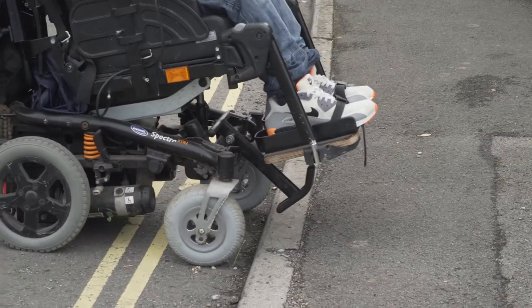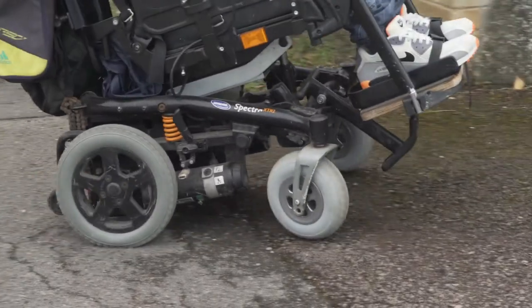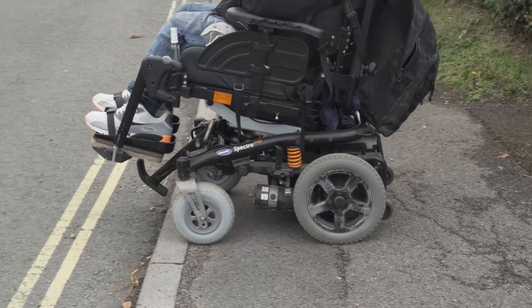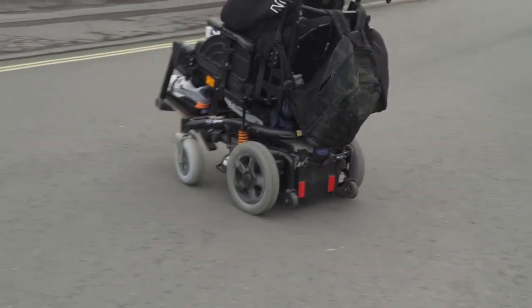You see that this is a bump, so you slow down and then you put the power in to get the back wheels over. But you wouldn't go up here — you would go up where you're standing, because where you're standing is flatter.